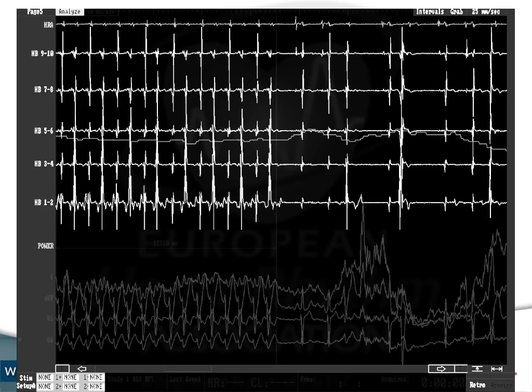During tachycardia you may see acceleration before termination. One challenge is that when rhythm changes, the heart shape changes and the catheter may move. A technique to overcome this is to set your stimulator to pace on demand around 20-30 milliseconds slower than the tachycardia cycle length, so that when tachycardia breaks, the pacing stimulator takes over at roughly the same rate, maintaining heart shape so your catheter doesn't move when tachycardia breaks.